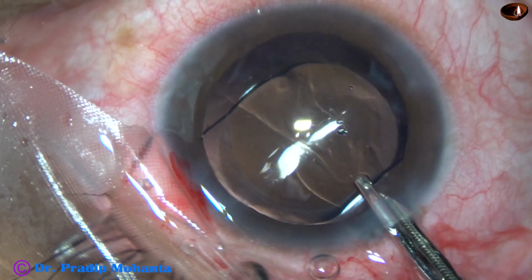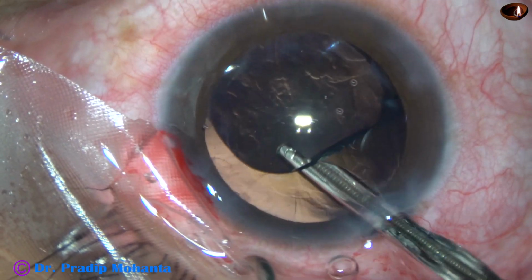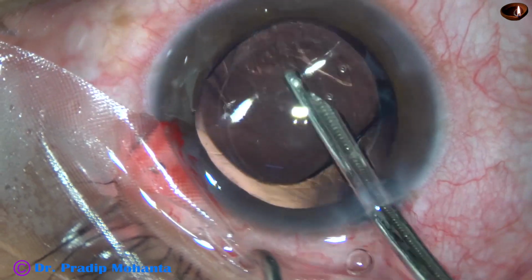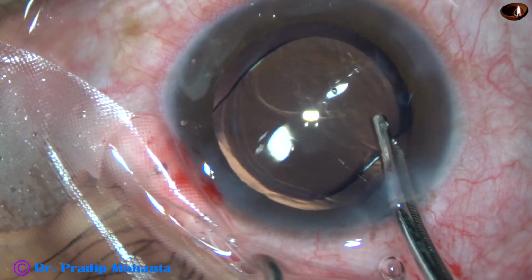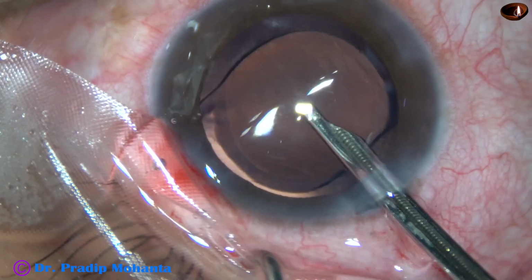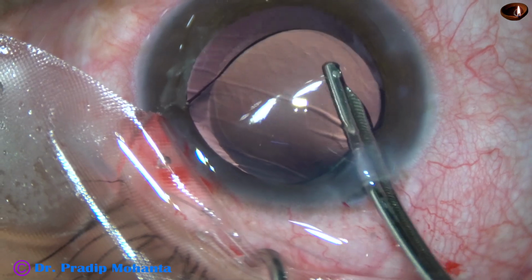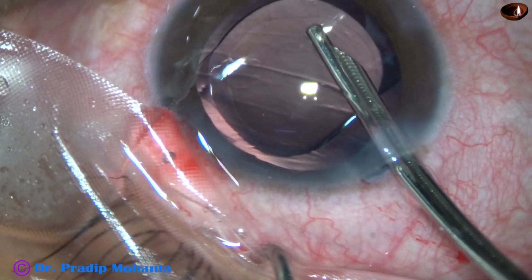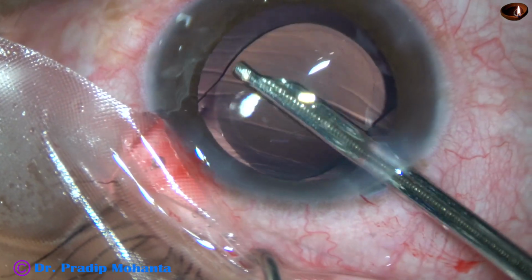And now the visco has to be cleaned very nicely. First, I irrigate for some time, irrigate both the capsular bag and the anterior chamber for about 1 minute, and this will cause removal of most of the visco. We must dedicate some quality time for removal of visco so that post-op rise of intraocular pressure doesn't occur.